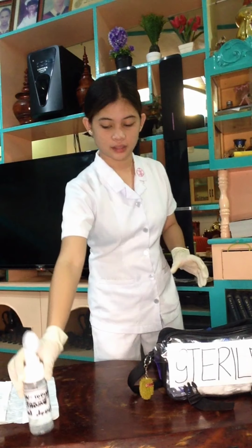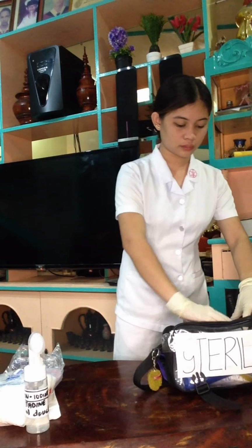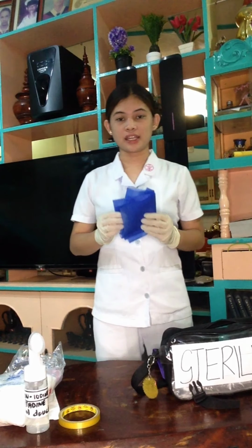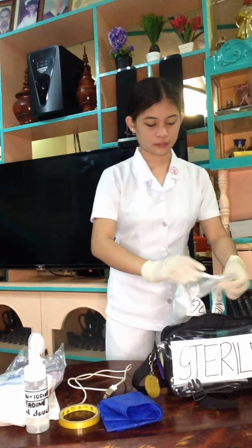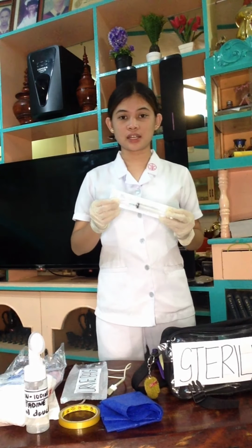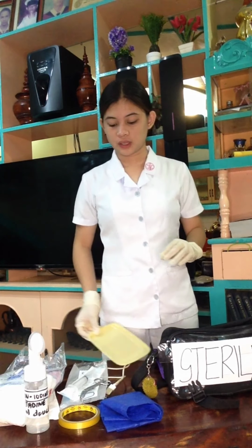So, we have here a betadine for our cotton, and of course, a cotton, a tape, an eye sheet, a catheter, a urine bag, a 10cc syringe, a forceps, and a kidney basin. Our table is sterile because our items are all sterile.